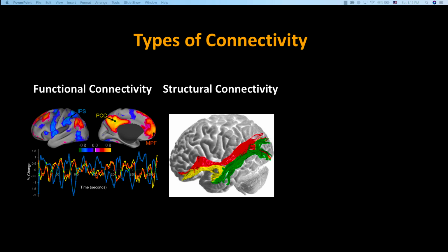Anybody done any diffusion analysis, DTI, things like that? Yeah. So that's a way to try to reconstruct fiber pathways that connect, in a literal structural sense, different parts of the brain. And somebody asked me actually, well, how can you match these two things up if I have, say, two regions of the brain in my functional data, the resting state, that are correlated? How do those map on with these structural connections? It's a good question. We don't have the time to go into diffusion analysis in this particular workshop. Maybe when I come back, who knows?